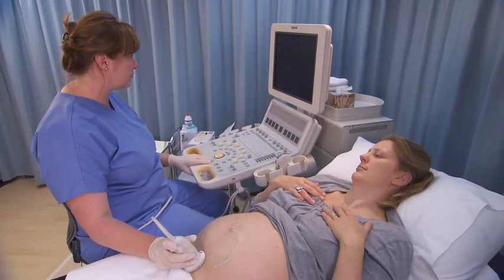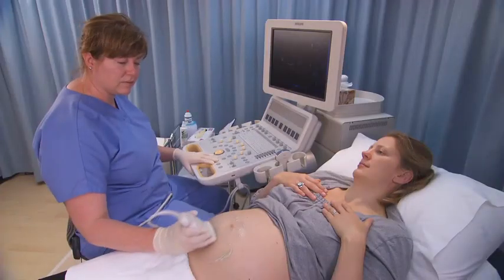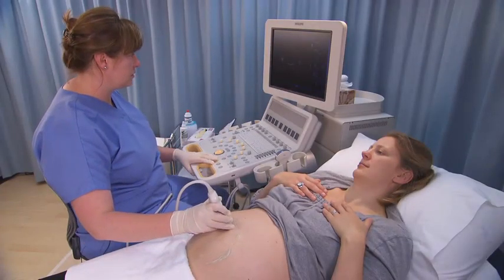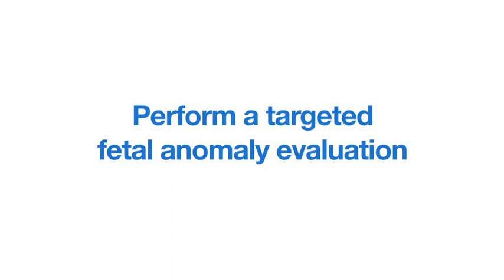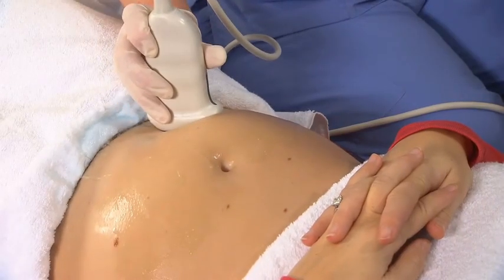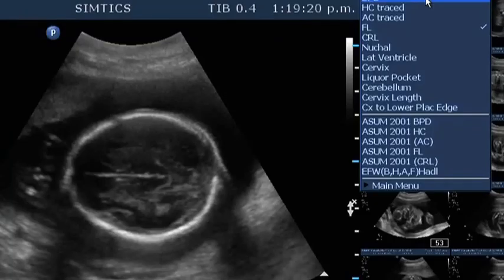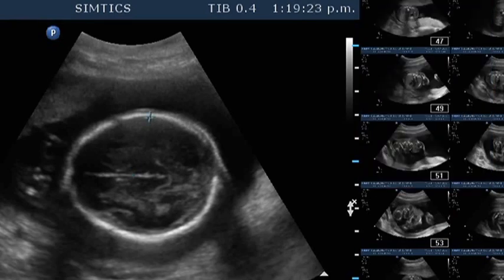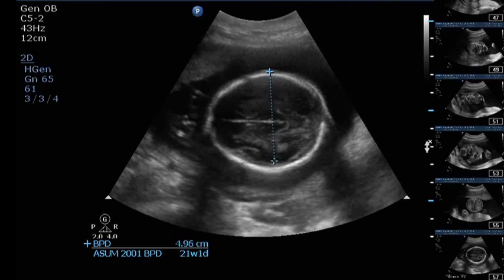The targeted fetal anomaly scan is usually a follow-up scan for a previously identified anomaly, or when a high risk of fetal abnormality has been identified from screening or maternal history. It is assumed that a sonographer performing a targeted fetal anomaly scan knows how to perform a second trimester anatomy scan. This video will show some of the more detailed steps that may also be required.